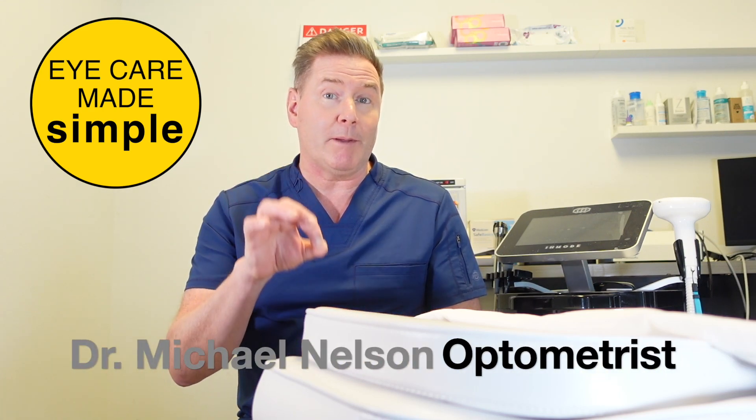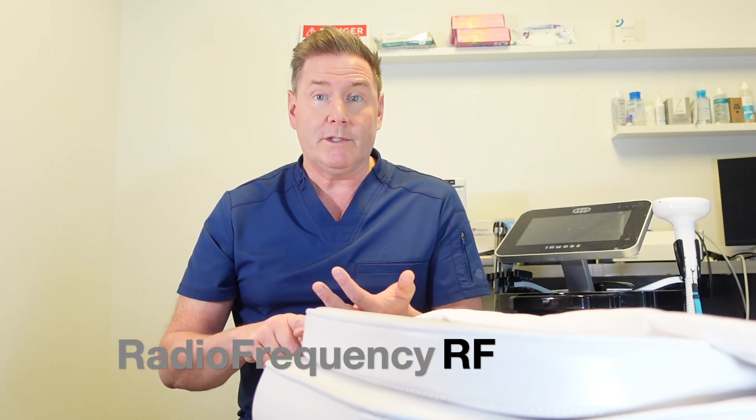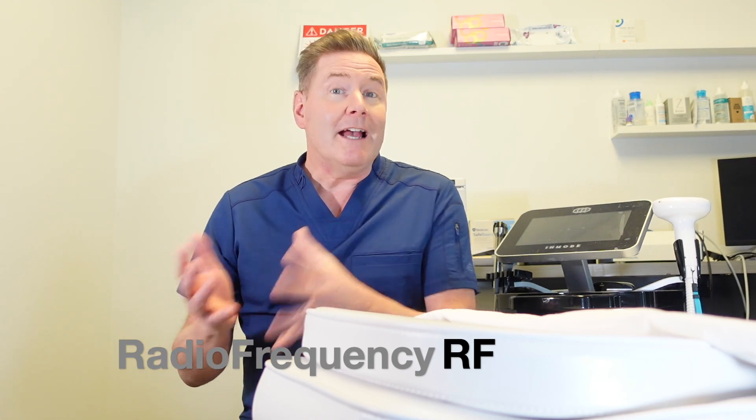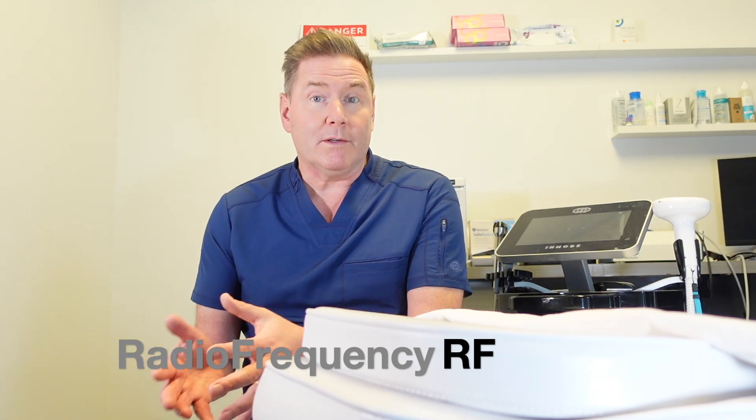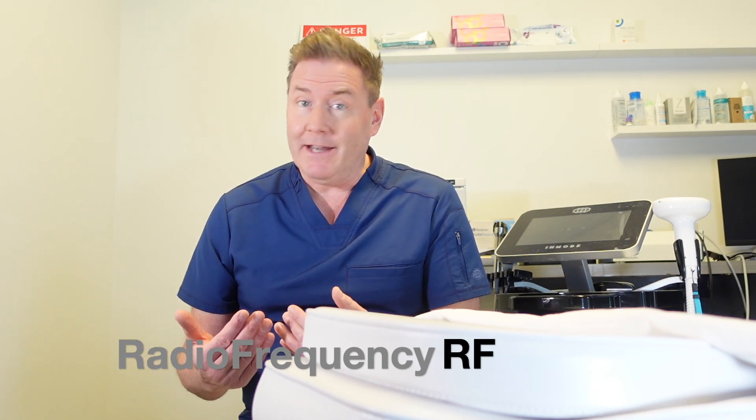In this short video I'm going to explain everything you need to know about radio frequency — how it works, who it's for, and does it even work. Dry eye can be absolutely miserable, and what's worse is that dry eye never gets better on its own. If you don't actively treat your dry eye disease it can become much worse and become permanent.